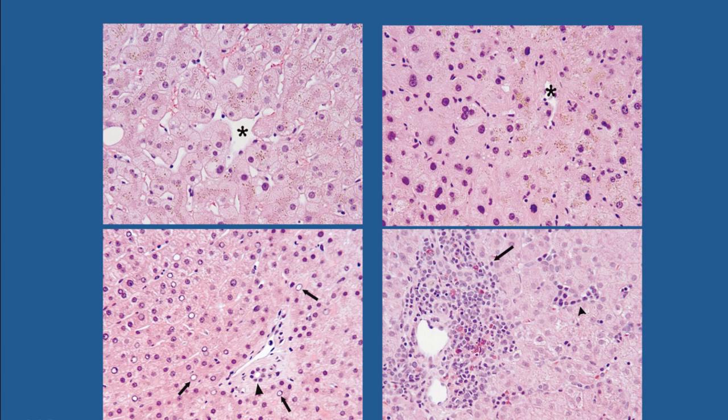So here on this panel, we have another liver biopsy. You see the central vein. You see that there is much more pigment over here. This is probably an older patient. And also to go along with that, we have cells that are binucleated and multinucleated. And binucleated and multinucleated cells are usually seen in older patients.